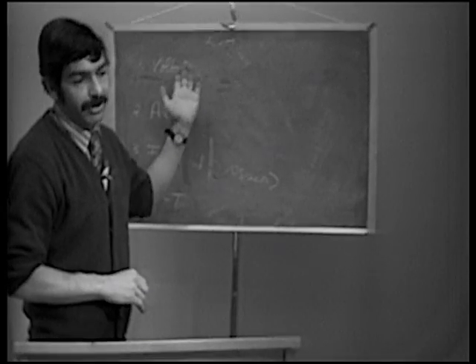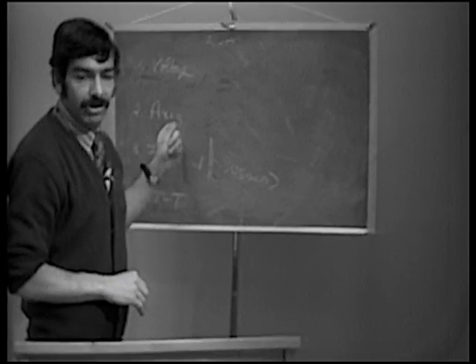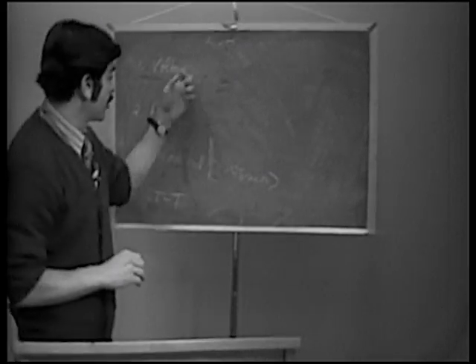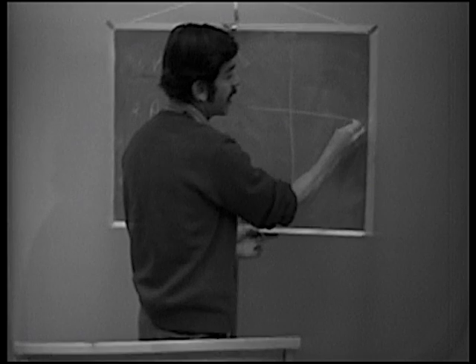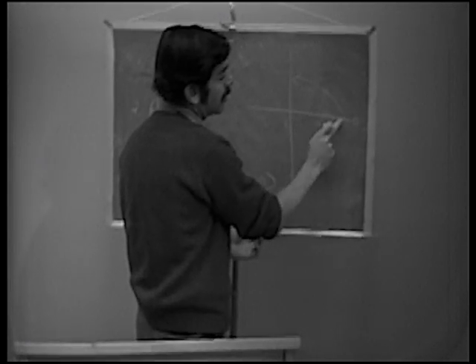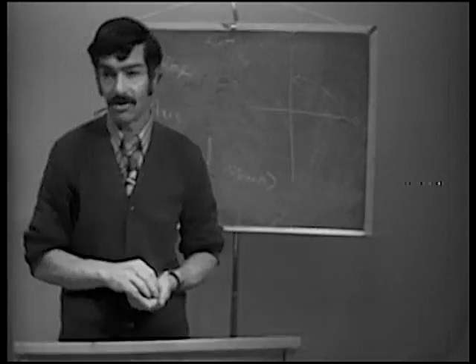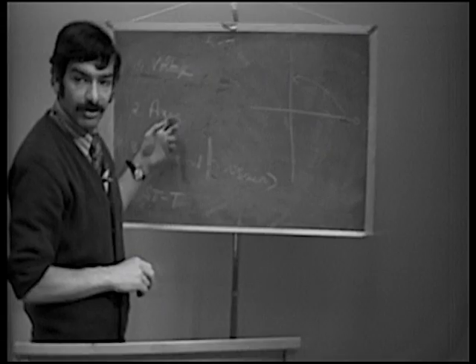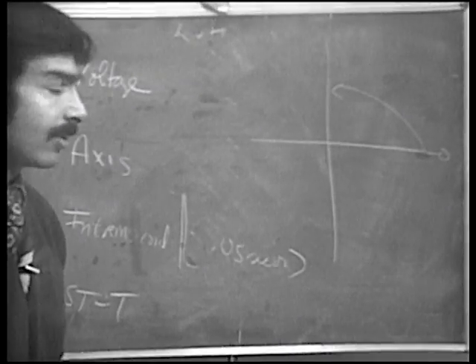Now, in the younger patient, somebody, let's say 20, 25, or even teenage, axis actually is a better criterion for LVH than is voltage. And as a matter of fact, in a young person, if you see an axis that becomes more left than 0 degrees, this is somewhat suggestive of left ventricular hypertrophy. Okay, so axis in a young person, that's an important point to keep in mind. Axis in young persons can be more reliable than voltage.